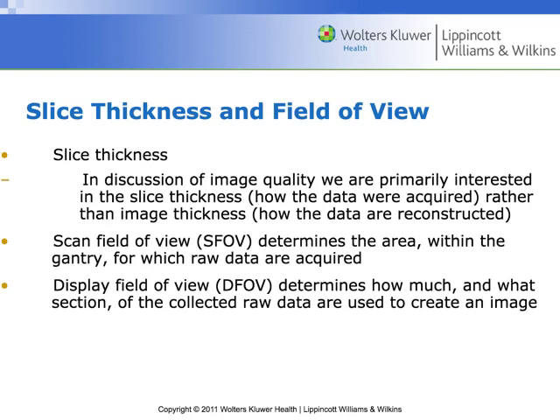So, another thing that we have direct control over is the slice thickness and the field of view. Now, some of this is going to be determined by the protocol. So, before we start messing with the slice thickness, we need to consider, okay, what are we looking for? How best can we image that? What is our protocol for this? Field of view, we have some direct control over. For field of view settings, we can actually dial in what the field of view is for the scan. And that is simply a matter of giving it limits to the area that it's scanning.